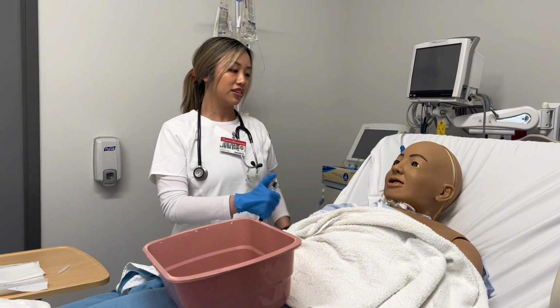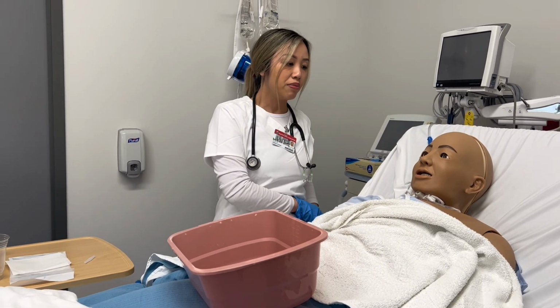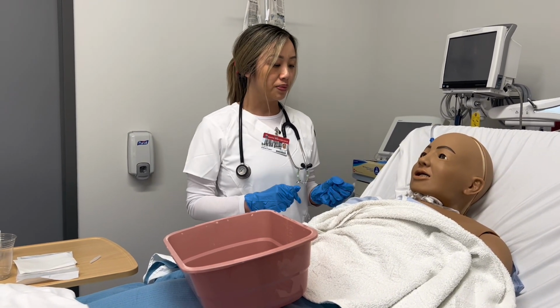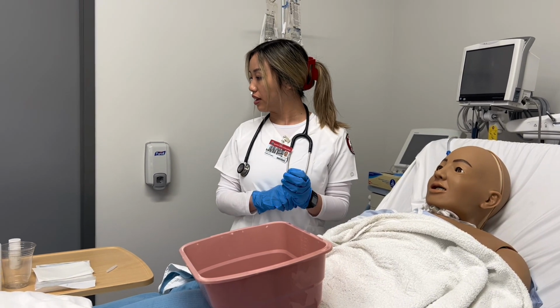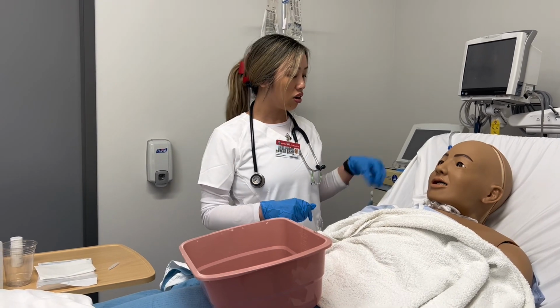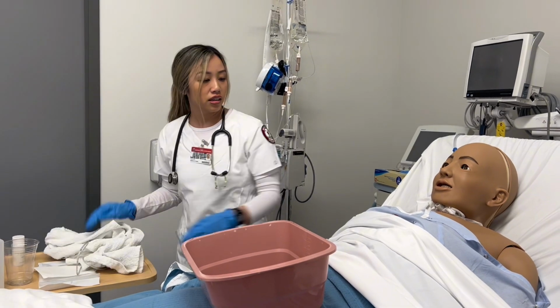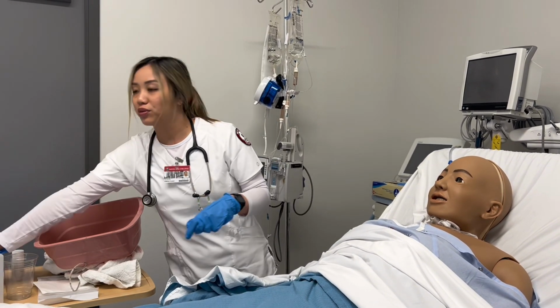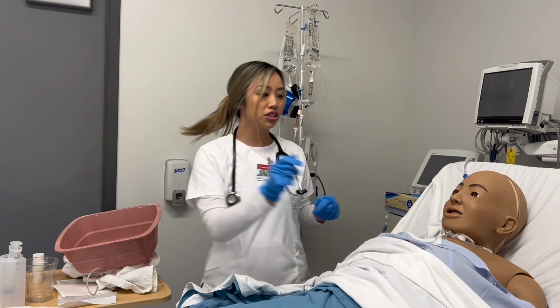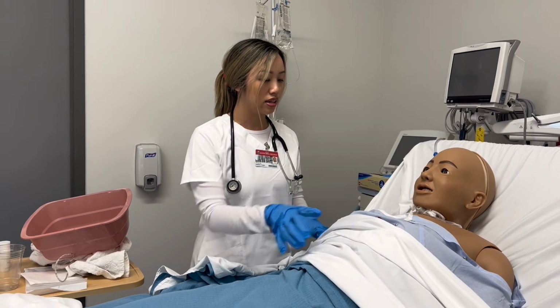Looks good there. Okay, so then at this time I would go ahead and check his respiratory status, making sure that we're not in any type of distress or anything like that. And then at this point I would go ahead and document everything too. And then I have the call light here, so I would remove this here. And then I would go ahead and give him some mouthwash. And then I would go ahead and give him some tissue just to wipe him up too. And then I would go ahead and document it.